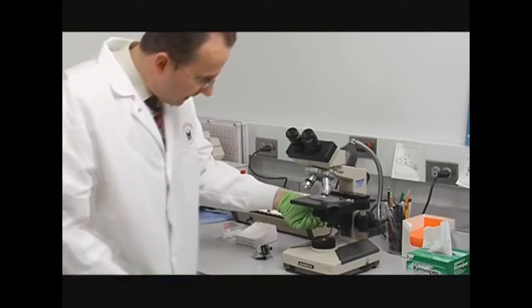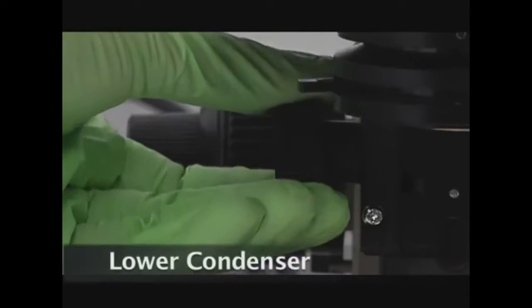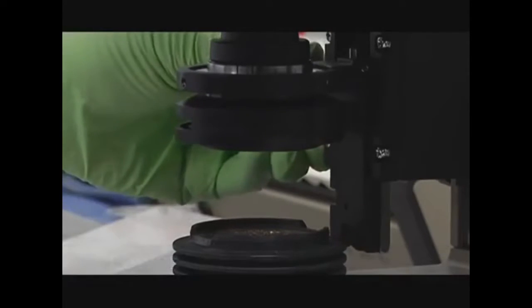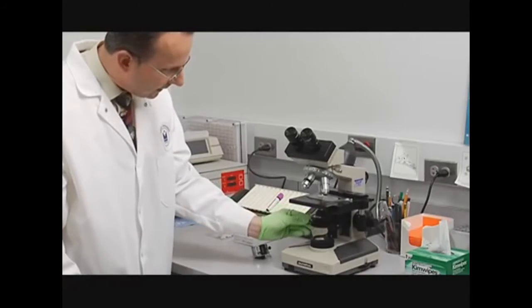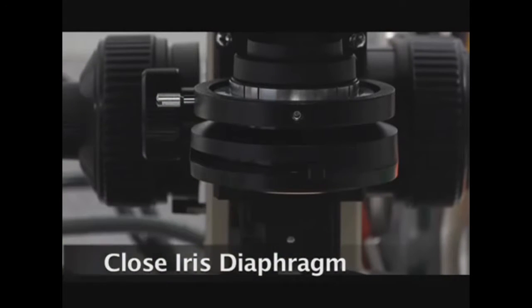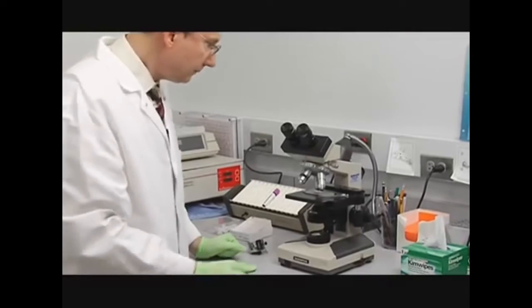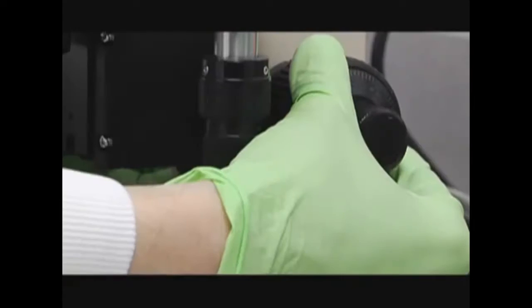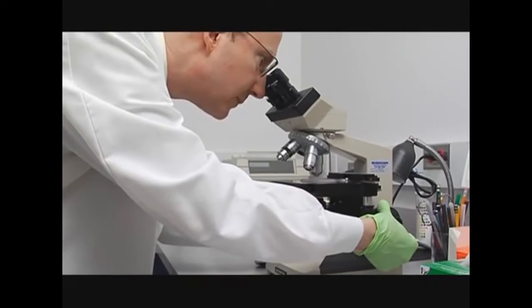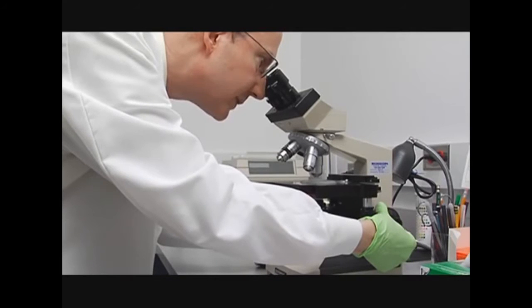Now at this point you'll lower your condenser and then close the iris diaphragm. Now lean over the microscope. Looking through the microscope, you're going to lower the stage away from your objective with the coarse focus knob until the rulings come into focus.